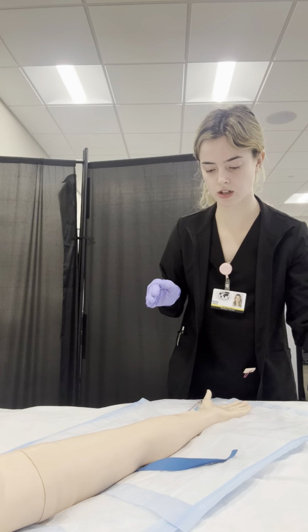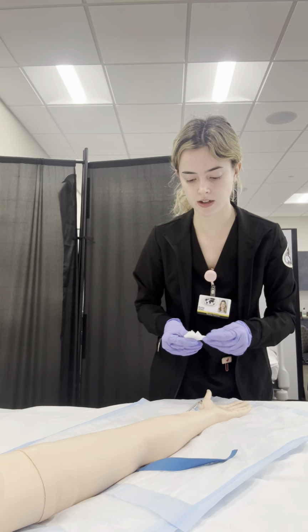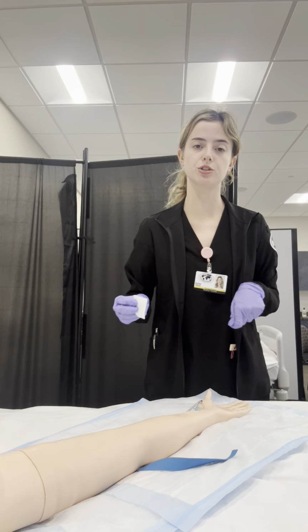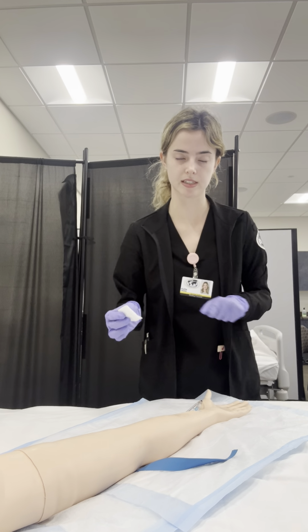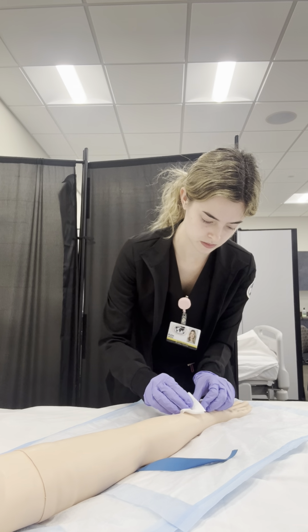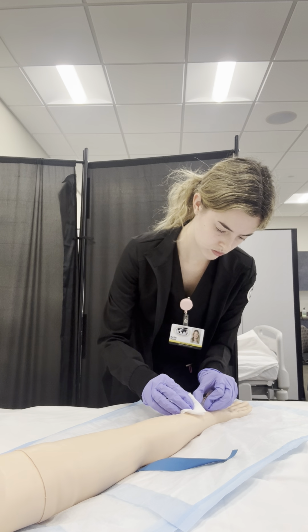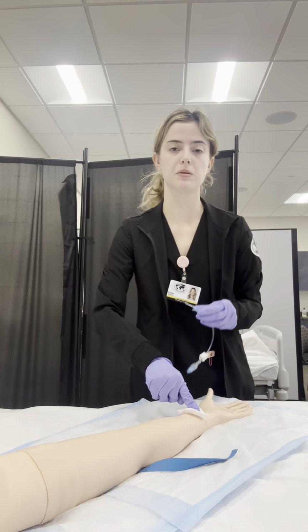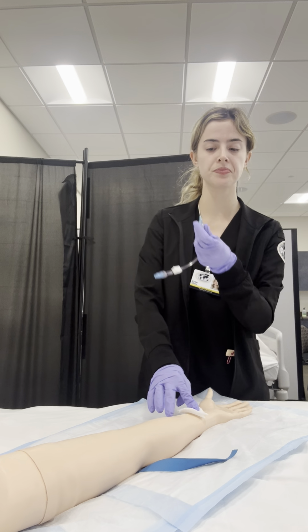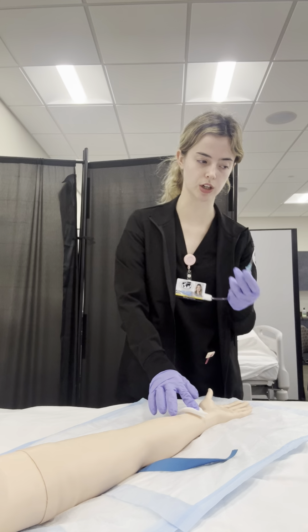So while the catheter is still in, I'm looking at the IV insertion site, no abnormalities. So I'm going to grab my gauze and I'm going to remove the catheter flush with the skin and apply firm pressure. Okay, I'm applying firm pressure with the gauze. I want to check the catheter after I remove it, make sure that it's still intact, no damage, so this one looks good.